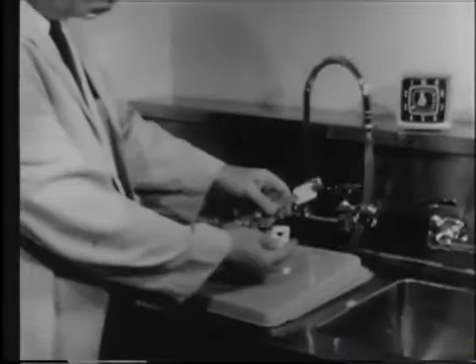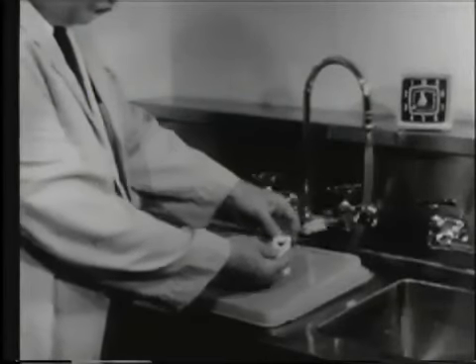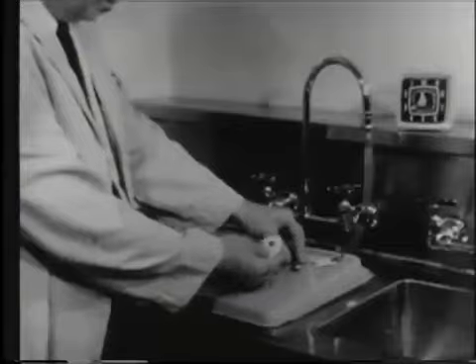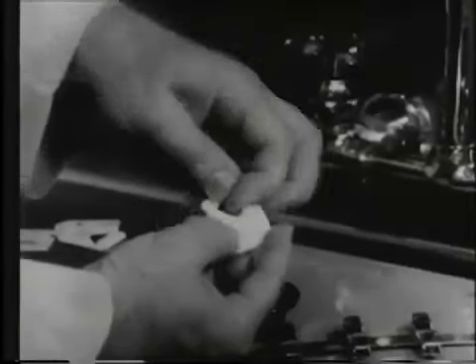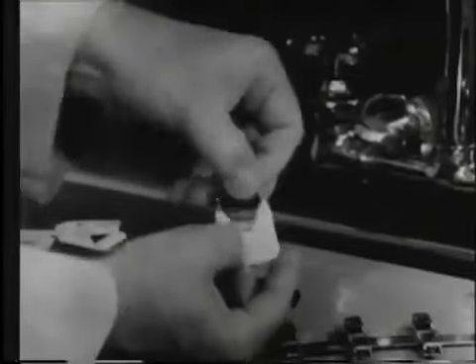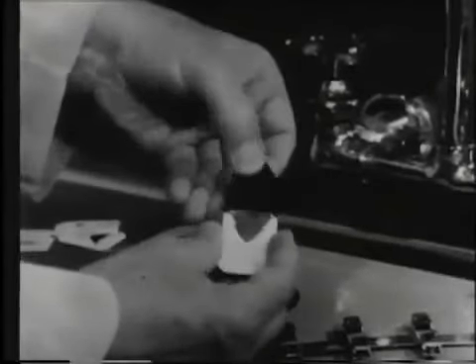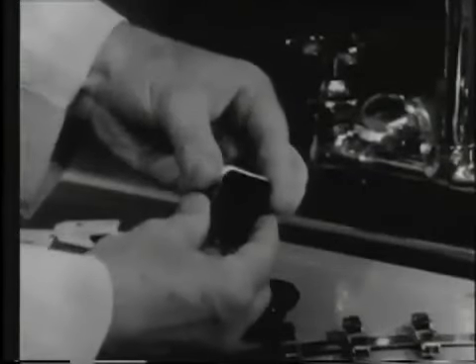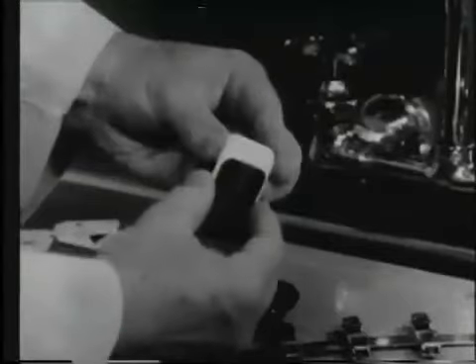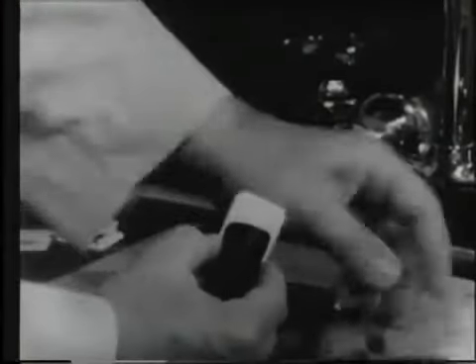Now I want to fasten this film, or the films in this packet, onto the rack. There are 2 sheets of film in this particular packet. That's what it says on the back of the packet. So we open it by pulling on this tab. And then we continue to pull, and between the black paper there are 2 sheets of film. We're handling them by their edges so as not to leave fingerprints on the surface of the film.